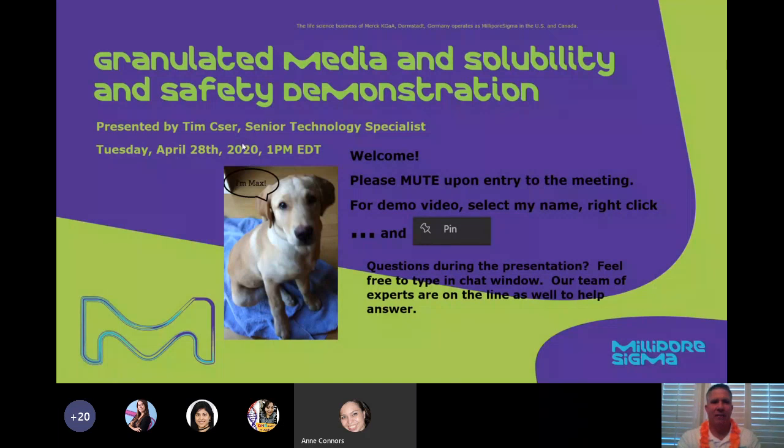I am a Senior Technology Specialist with Sigma, and we're doing these weekly webinar videos, demonstrations, just to give some more information out there while we're all working from home and staying safe. So I'm going to get started. This one today is on granulated media and solubility, and it's kind of on media in general.